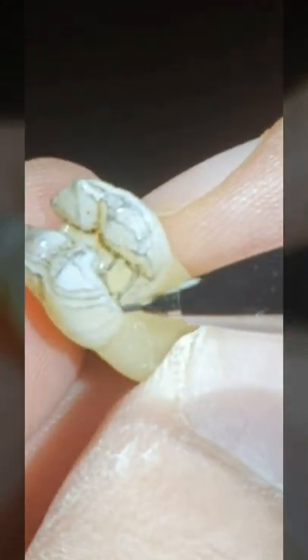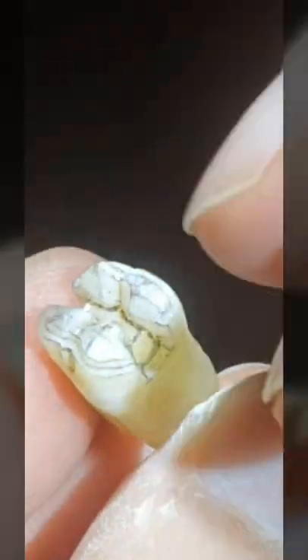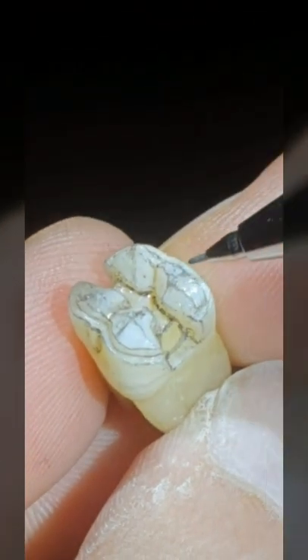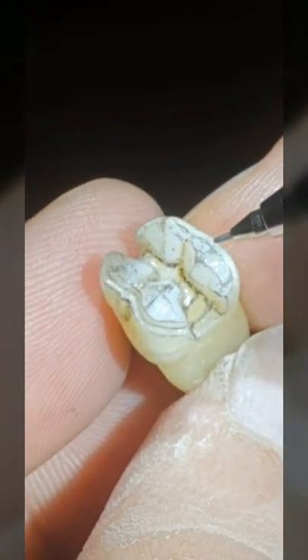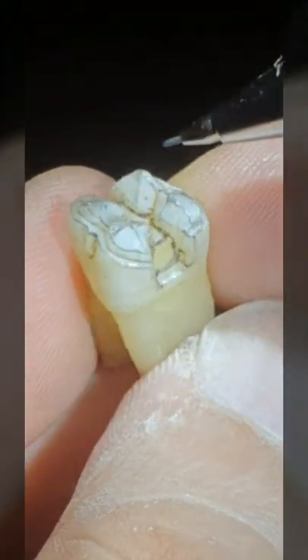So this as full strength will be tied together, and upon occlusion loads the margins won't deflect to open up from here or there. So if I were to even do a gold onlay, I would still do these margins. It would give structural strength like pillars to the margins, and upon occlusion loads the margins would not open up.